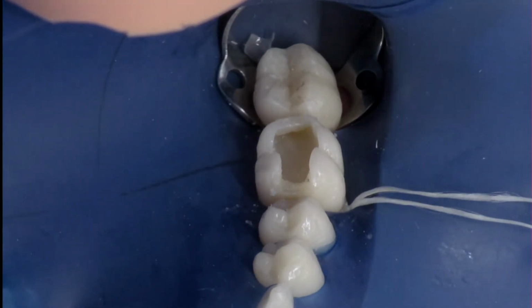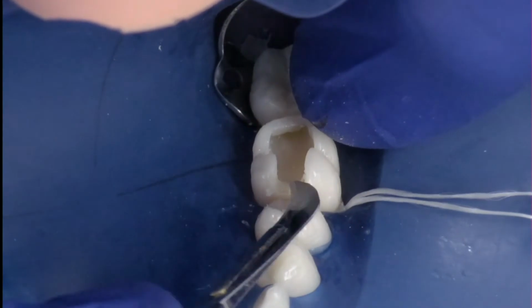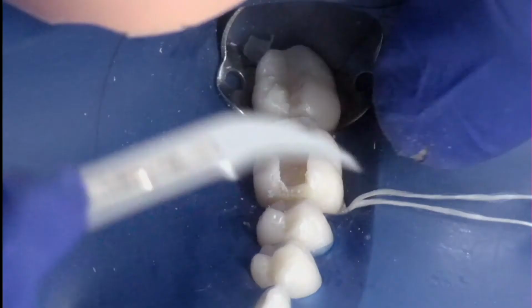And next up, I realize I'm still a little high, so I'm going to use a 12 blade to try to remove some composite so I don't have to re-etch, by avoiding using my burr.